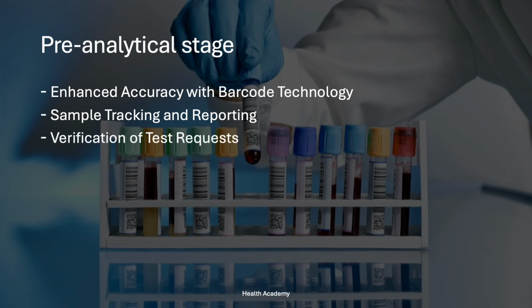Verification of test requests. Before proceeding, it's essential to verify the request form against the test tube's labeling and the specific tests ordered. This step is vital to prevent any discrepancies that could lead to incorrect testing or misinterpretation of results. Assessment of sample volume. Evaluating the sample to ensure it meets the necessary volume requirements for the requested tests is critical. Insufficient sample volume may result in the need for recollection, delaying diagnosis and treatment.